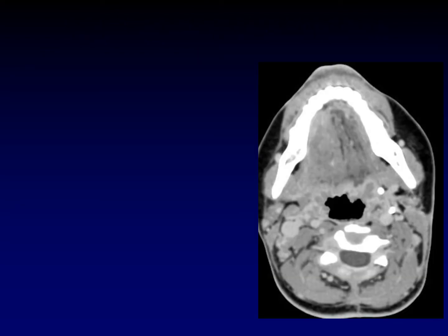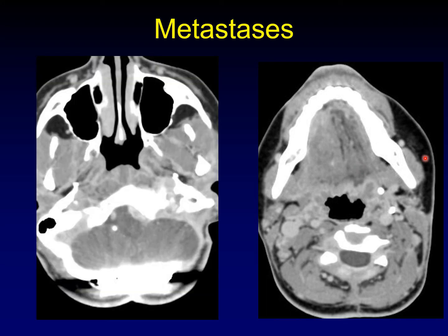Here is another example with hemi-tongue atrophy: fatty replacement on one half, normal muscle on the other. Looking to the hypoglossal canal, we find a large skull base metastasis secondarily invading into the hypoglossal canal as the cause.